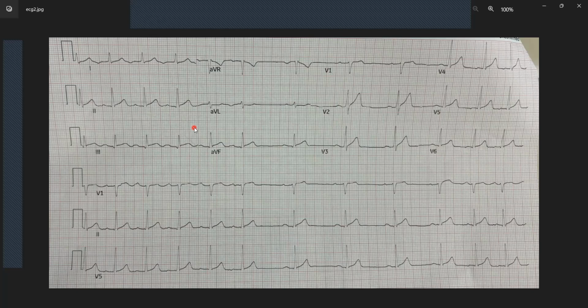And then the third one that we have is pericarditis, which in a 37-year-old relatively well person is probably the one that you'd want to quickly try and rule out or rule in immediately. Now, in this case, we see a slight PR depression, although it's not as widespread everywhere else. There's just one here. So that made me lean more towards a pericarditis.